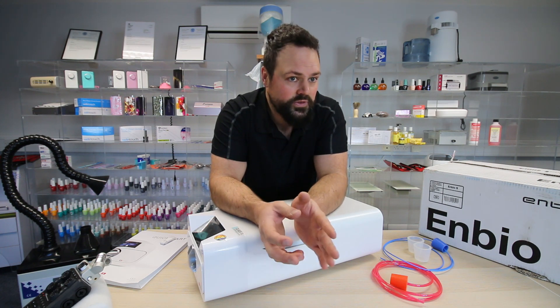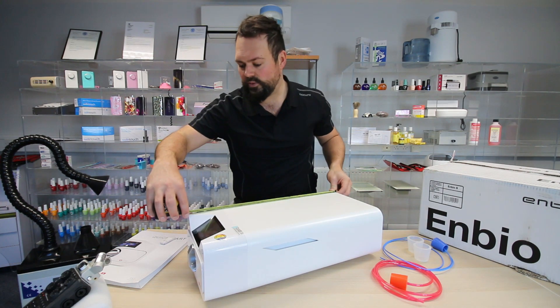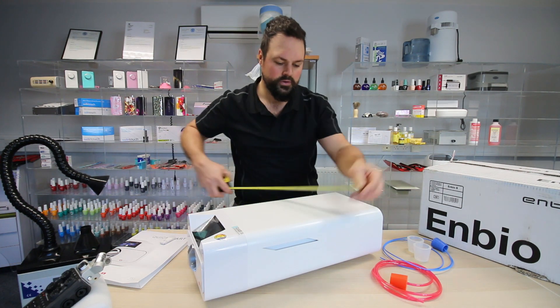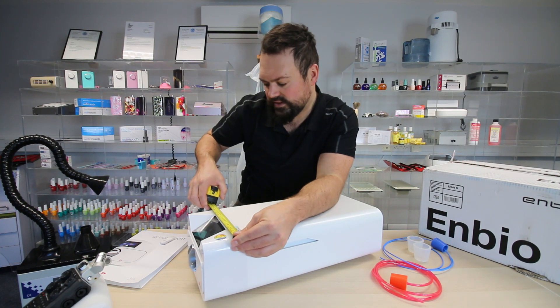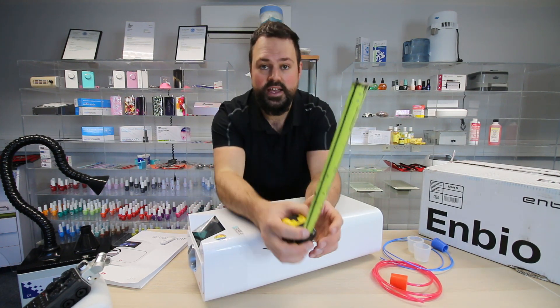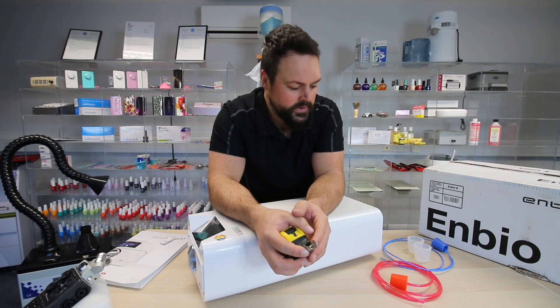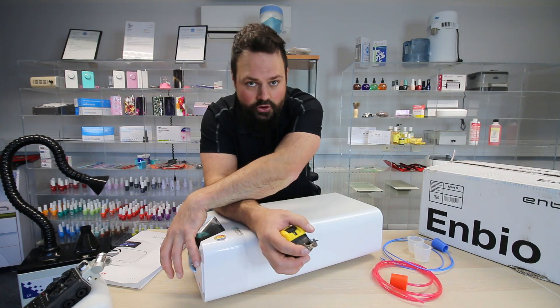In terms of the dimensions and size, the length of the unit is 55 centimetres long, 26 centimetres wide, and 16 centimetres high. So it's very compact. The only thing you've got to consider is the water container. We'll touch upon the size of the drawer in a minute.